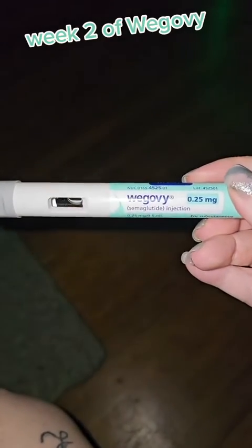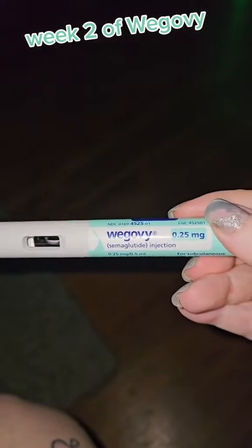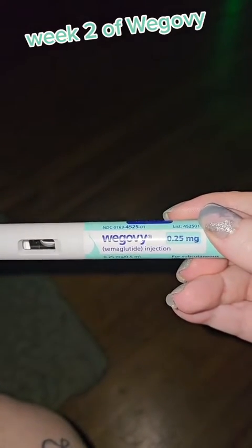All right, so this is my second shot. You can see the medicines in there, and I am on the 0.25, and we're going to do it in the thigh.